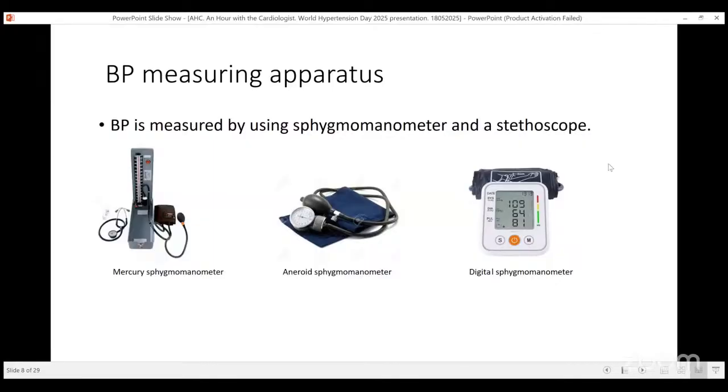So please, if you have only the wrist blood pressure measuring device, while it can be a guide for you to know what your blood pressure is, try your best to at least check with the digital one that you put around your arm once in a while, and get the accurate measurement of it.